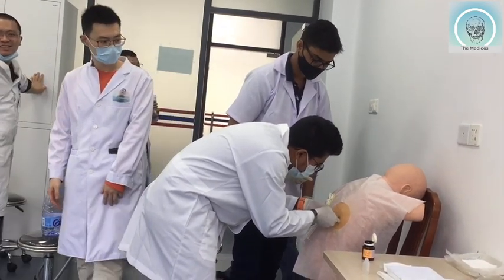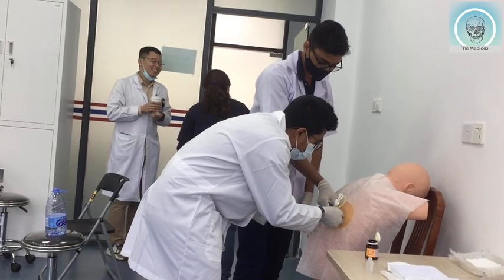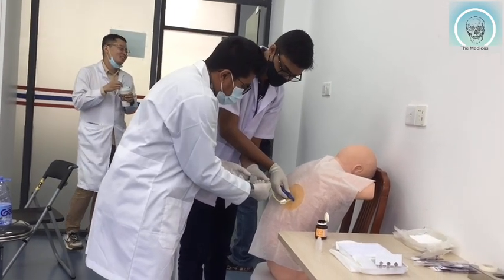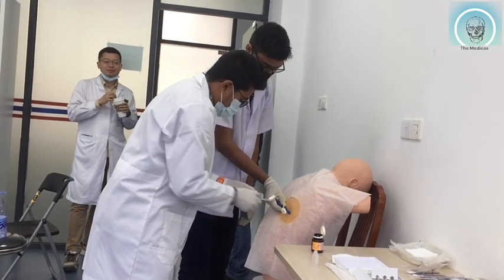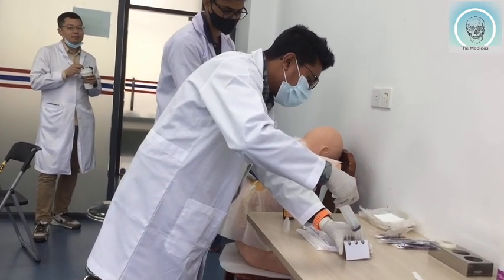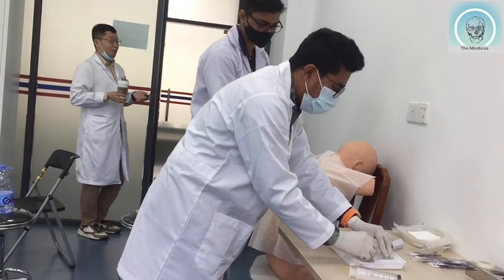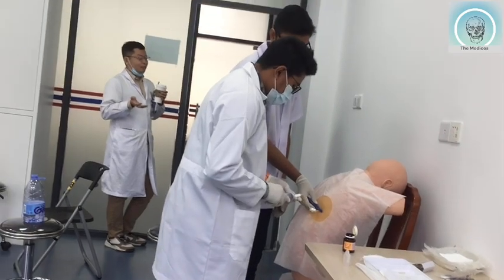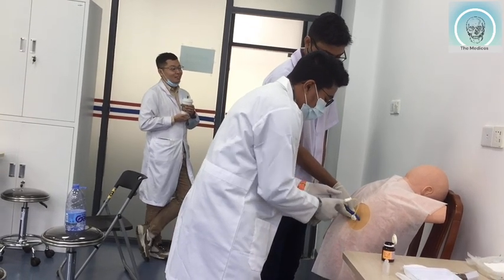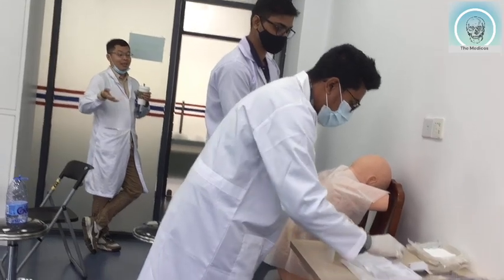When complications do occur, they are usually minor or are easily treated. Potential complications include pain, feeling faint, bleeding, infection, pneumothorax or collapsed lung, liver or spleen puncture, and pulmonary edema. After the procedure, the doctor will observe the insertion site for signs of bleeding and assess your breathing for signs of lung collapse, that is pneumothorax, or other complications. A routine chest X-ray is not necessary for patients who tolerate thoracentesis well. If the procedure was complicated, a chest X-ray or ultrasound will be obtained. The doctor will examine the fluid, particularly its color and consistency, and will also send the fluid for laboratory tests.